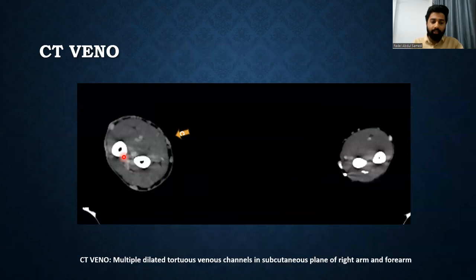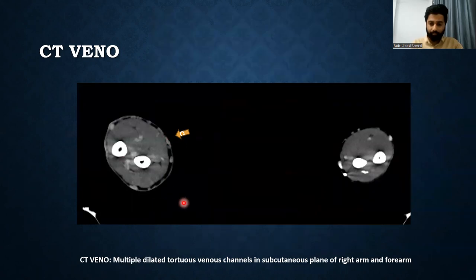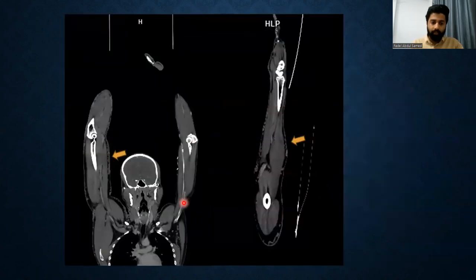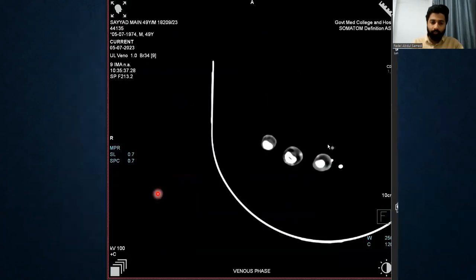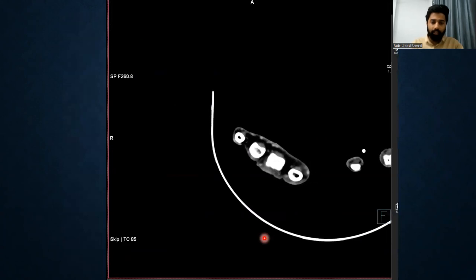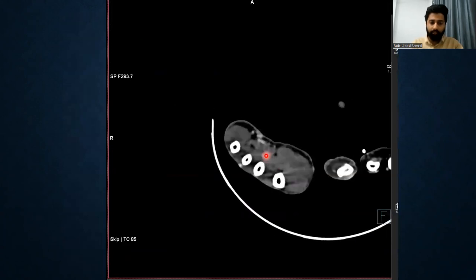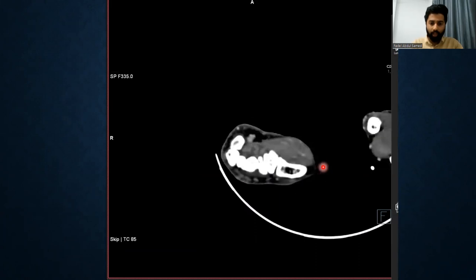On venous phase, on CT venography, we observed multiple dilated tortuous venous channels in the subcutaneous plane of the right arm and forearm. These are the coronal and sagittal reconstruction images showing the subcutaneous dilated tortuous venous channels. This is a video of the same, showing dilated tortuous venous channels in the subcutaneous plane of the right arm and forearm region.